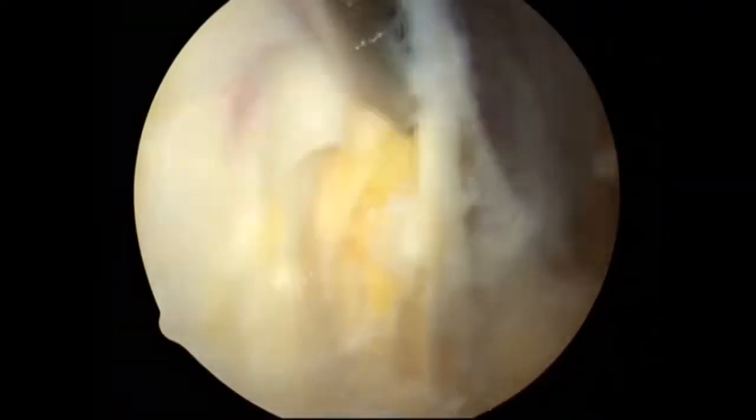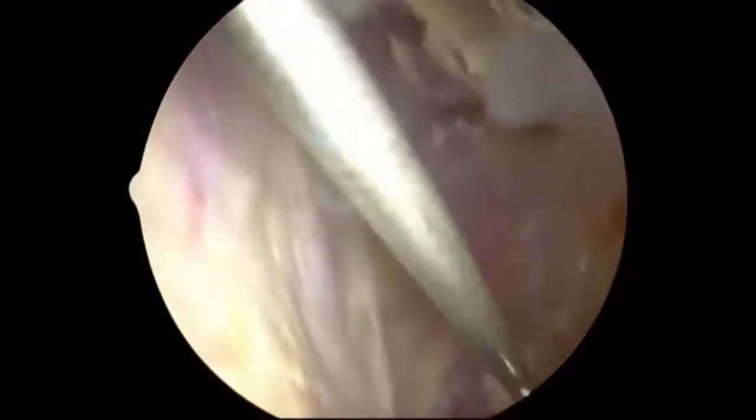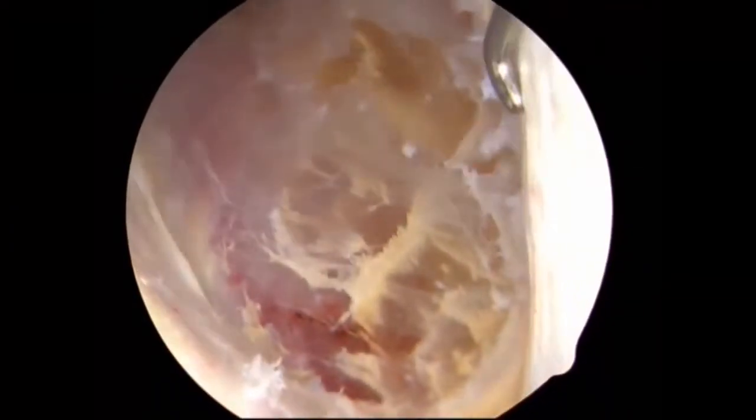Viewing from anterior, bursal tissue is being excised. The head is at the top and the foot at the bottom. The undersurface of the iliotibial band is being debrided of fibrous tissue. The vastus lateralis is seen on the right.